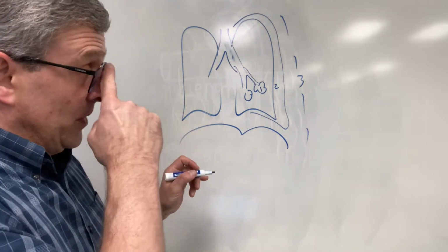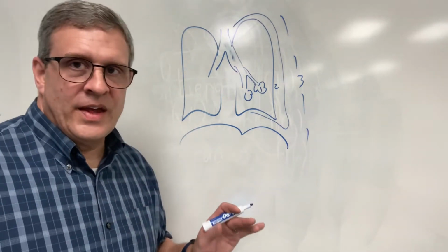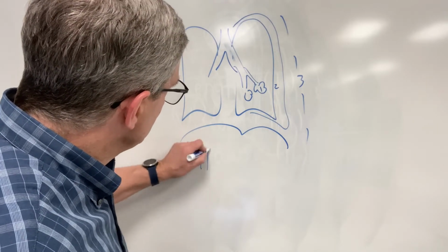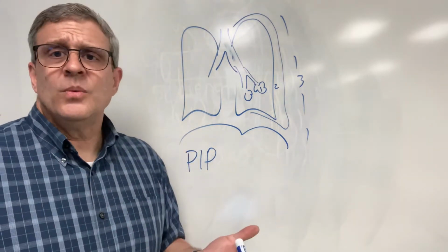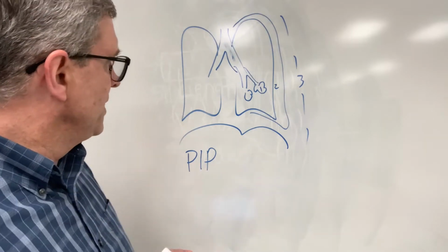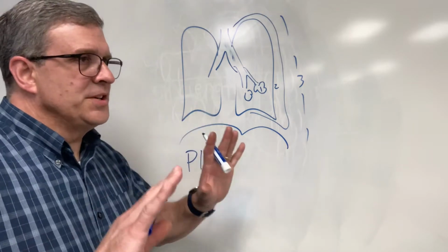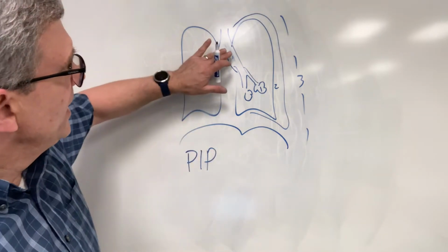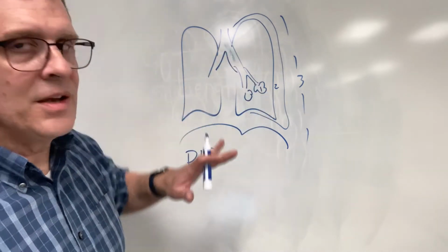And so there's a couple of pressures on the ventilator, and I'll show you this when we go over there. But the peak inspiratory pressure, well, respiratory therapists typically call that the PIP. That's going to be the peak pressure, the highest pressure that it took. That takes into account airway resistance and lung compliance.